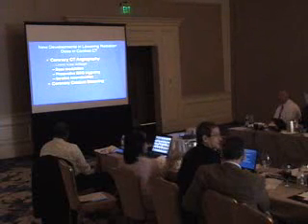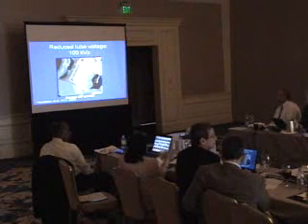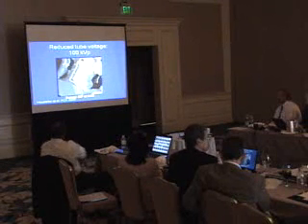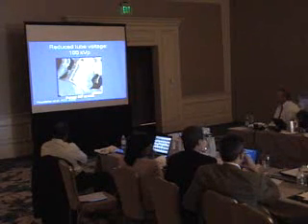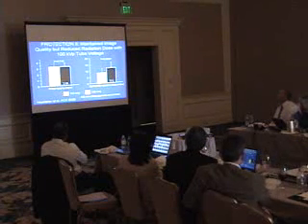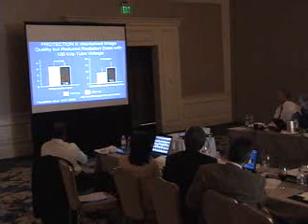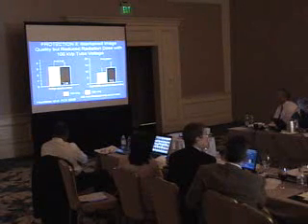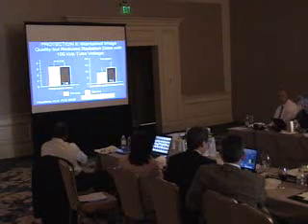The way in which the radiation is reduced is a combination of factors. One is the use of lower tube voltage. Generally, the voltage has previously been at 120 kVp. Hausleiter demonstrated 100 kVp in patients who are under body mass index of 30. It gave excellent images, as shown here. He demonstrated that the image quality shown on the left was no different at this reduced voltage, whereas the radiation exposure shown on the right was reduced by 40% by the use of 100 kVp. This has become the standard in CT in patients who are non-obese, using the lower voltage approach.